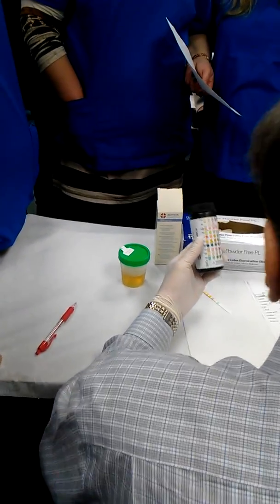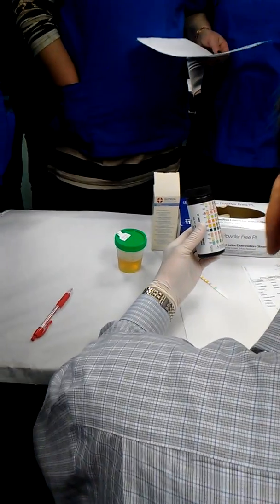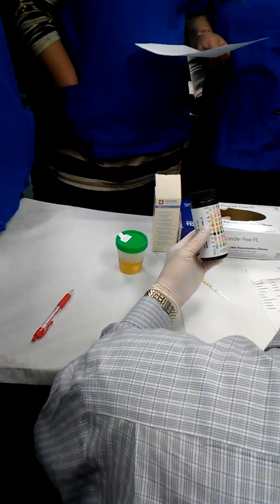Okay, next. Ketones. What are ketones? Ketones are substances appearing in the urine when we have a complication of diabetes mellitus, sugar disease, right?